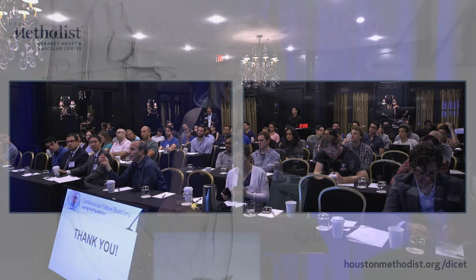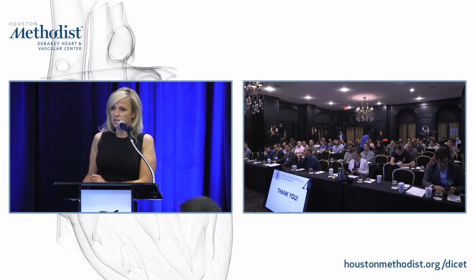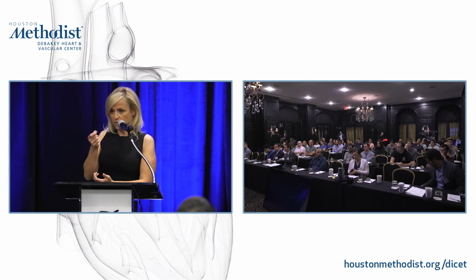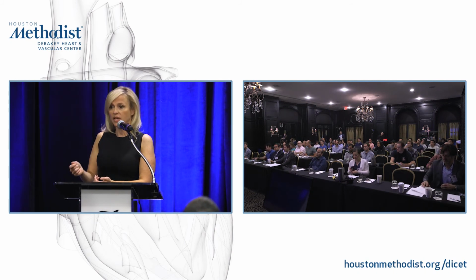Well, it's just a very tiny channel. The catheter won't work because you're sitting in this tiny, very, very small lumen. You know what I'm saying? And if you keep exchanging it right over that wire in that same lumen, you're going to continue to have a catheter in a very, very small vein, essentially. It creates a new vein. So by splitting that fibrin sheath, you're going to be back into your SVC again. Does that make sense?